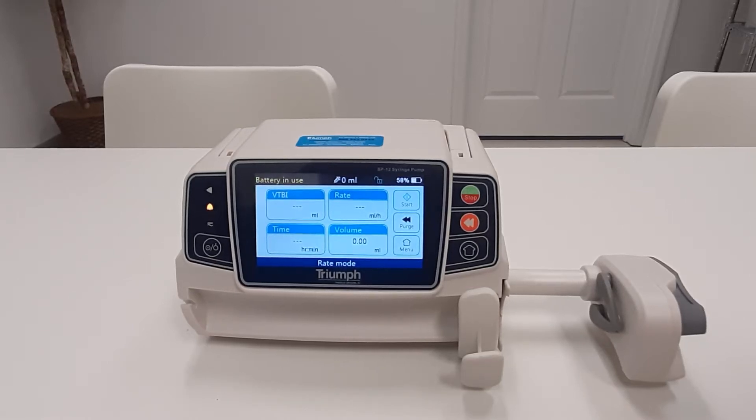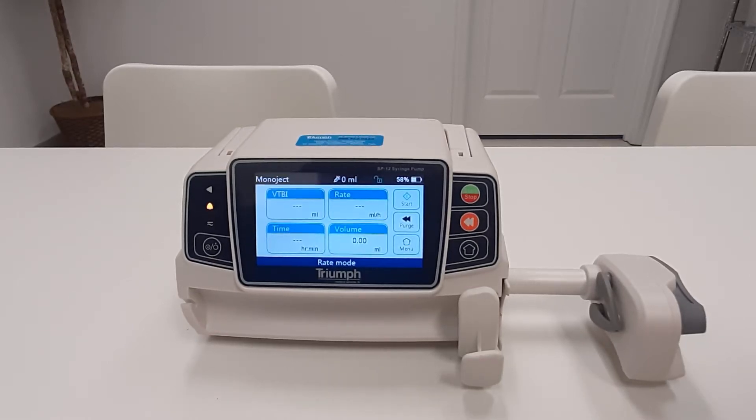In this video I will show you how to correctly load a syringe in the Triumph SP12 syringe pump. This will help avoid damage to the pump, which would result in sending the pump into our service department for a $295 repair.